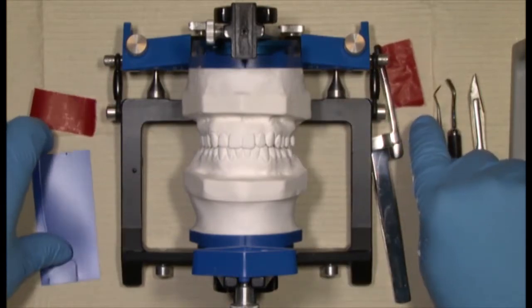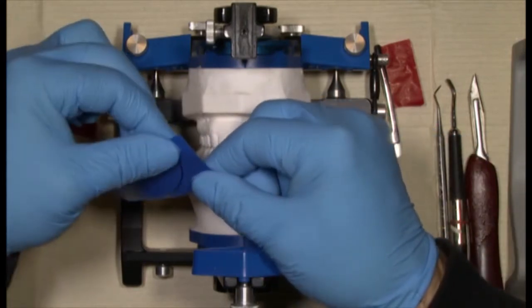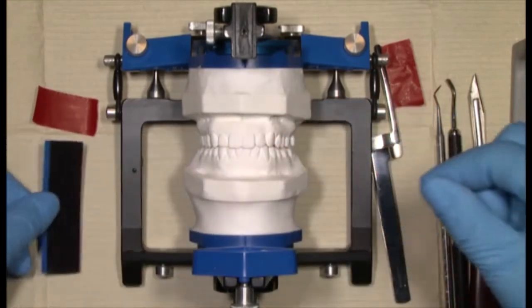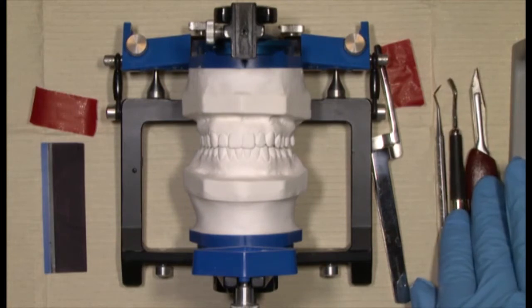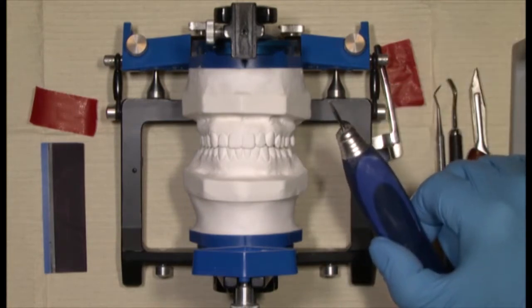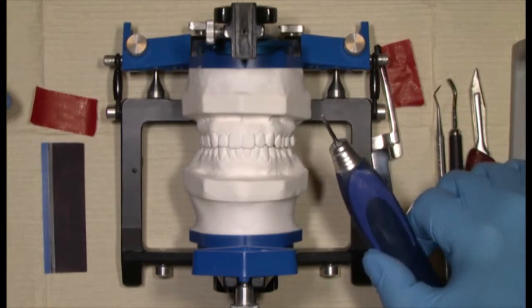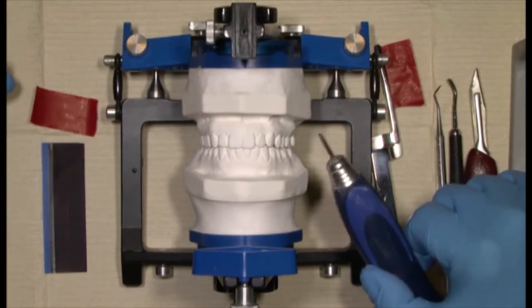If we take the articulating paper now and notice what we have out, we have both the Accufilm, the red, and the Troll foil, the blue. This would then be removed from its covering pack to be used. We also have a variety of different hand instruments to do the equilibration with, or actually a handpiece. I prefer to use the handpiece because it's quite fast, so that you can at least gain an understanding of what we're trying to achieve.